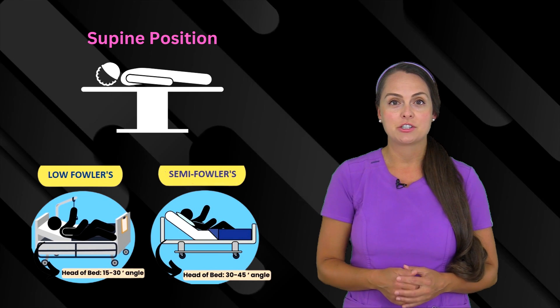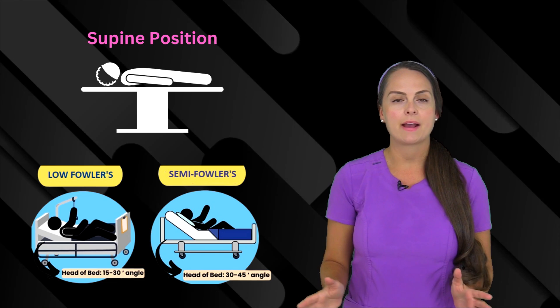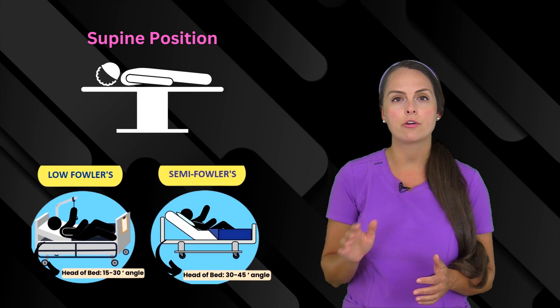Then you want to make sure your patient is positioned properly. It's best to get them in the supine position, so laying flat on their back. But sometimes patients can't tolerate that, so you can put them in the semi-Fowler's or low-Fowler's position.